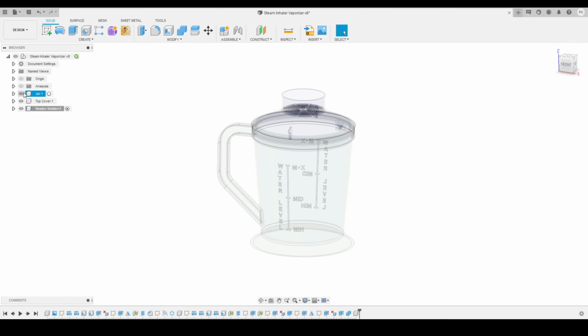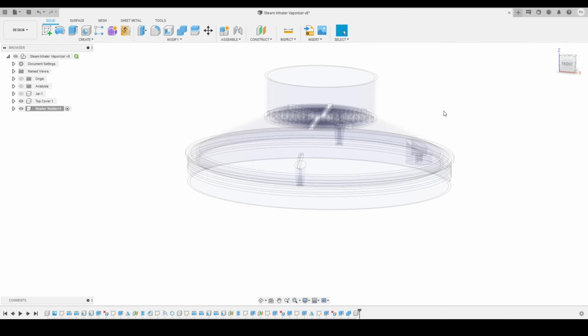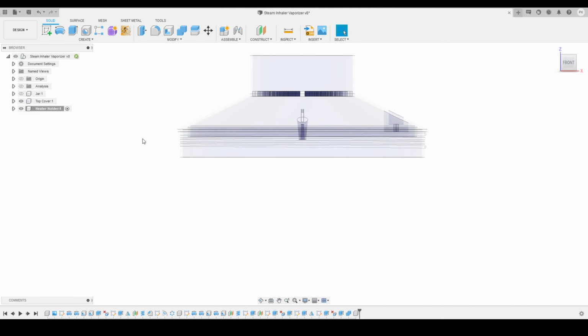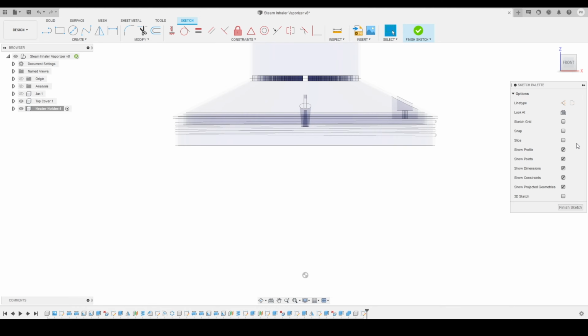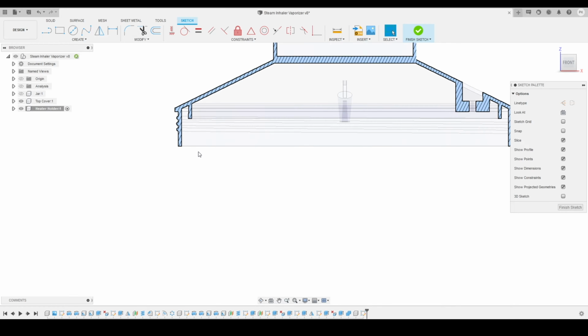Now I will turn off the jar component from here. So here you can see the top cover component, and I will go to front view, and now I will go into the create a sketch tool and select this plane as a sketch plane. Now I will turn on the slice tool from here, so I will see a sliced view of our top cover, and I'm going to use this as a reference body for sketching.